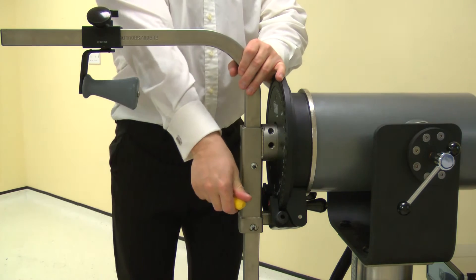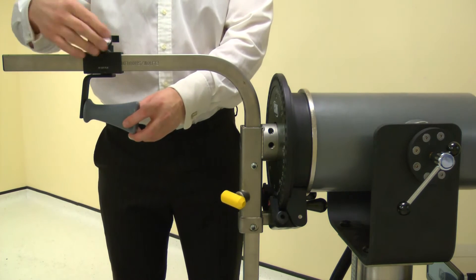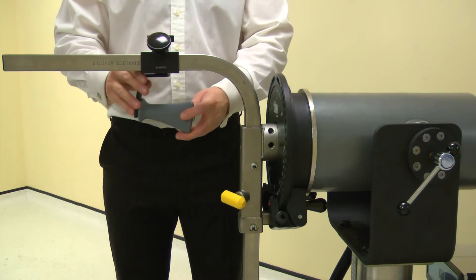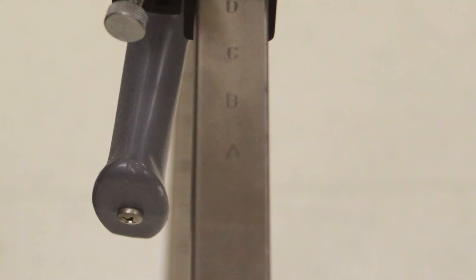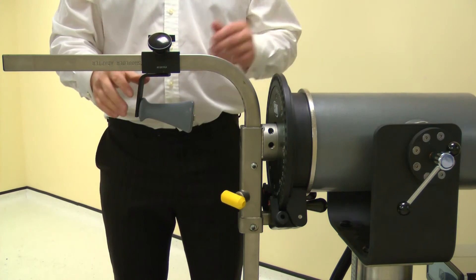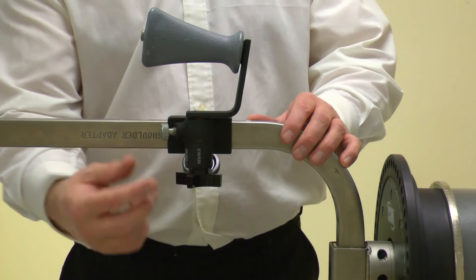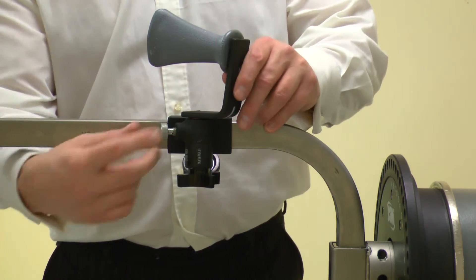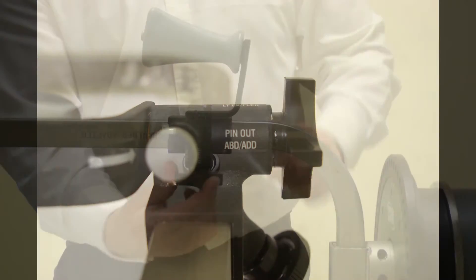Now position the hand grip. Loosen the screw and slide to the correct position; move the handle to position A. Note: this position may need to be altered to suit the subject. Secure using the screw. Adjust the handle rotation by releasing the screw then pulling the pin. Rotate the handle to position AB/adduction, then secure with the screw.